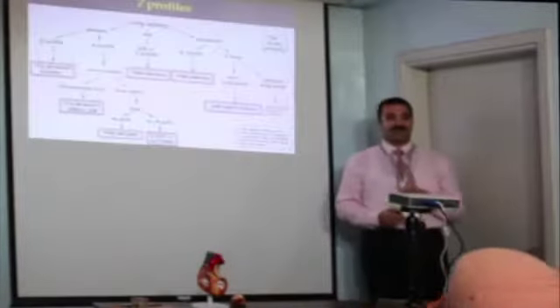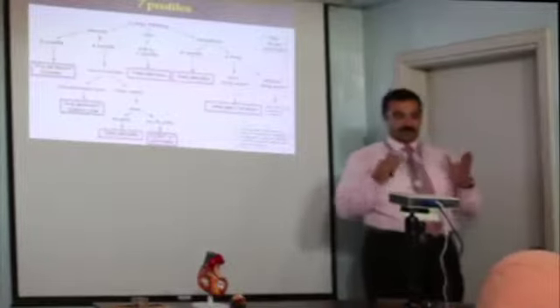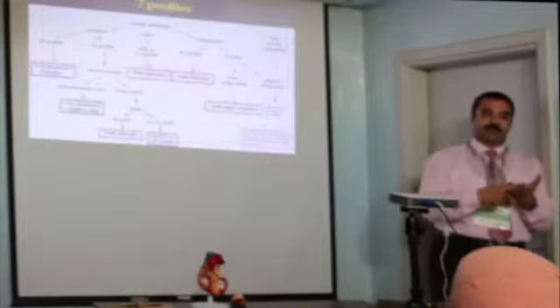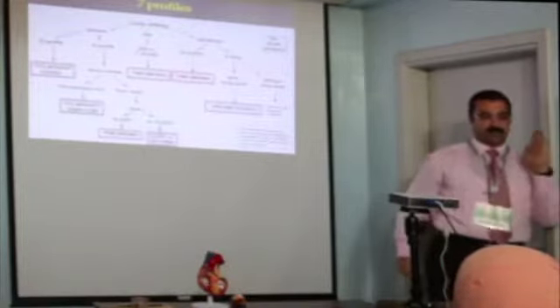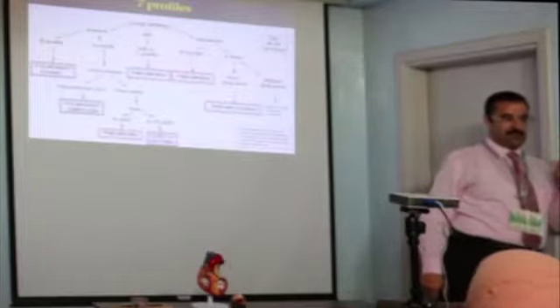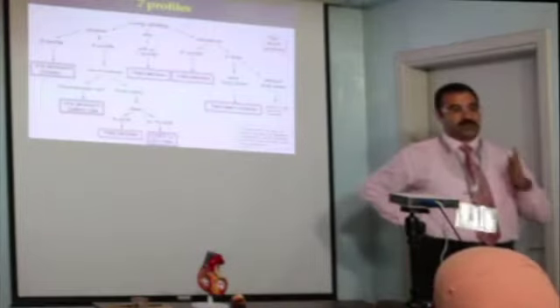Have your last look for now. Does anybody want me to repeat this one? It's a matter of practice, believe me. In the hands-on, you will just see normal A lines, some positive B lines, and lung sliding plus the seashore sign. Okay? And we'll do the diaphragm ultrasound to see the diaphragmatic excursion. This is the maximum you can see in the hands-on. Those ones you will see in the ICU once you start to practice. I promise you, each mechanically ventilated patient you touch will show one of these: pneumonia, atelectasis, effusions. There's always a finding, or almost always.